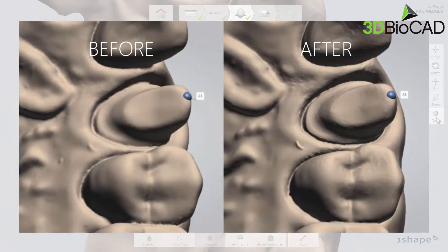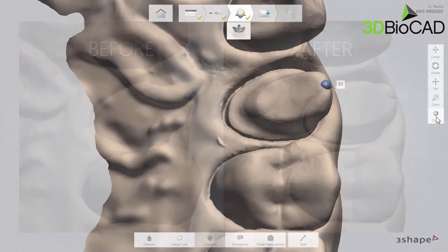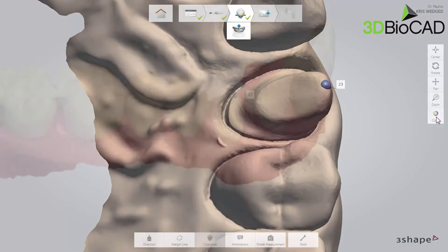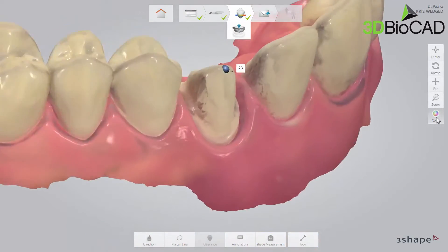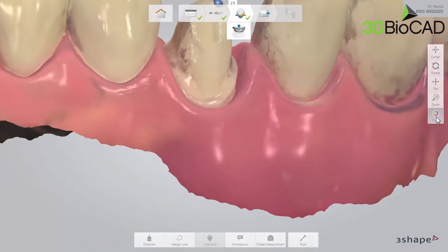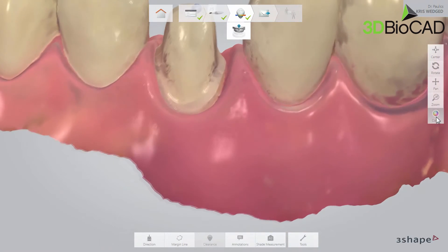Now the case is post-processed — note how the level of detail has now increased. The dental lab will always see the post-processed scan, because it is automatically processed during the sending procedure. Now that the scan has been post-processed, you can place the margin.